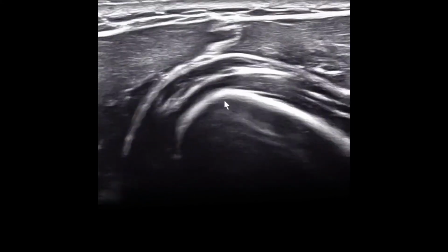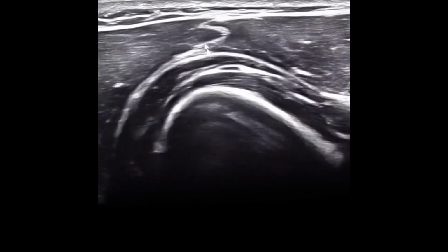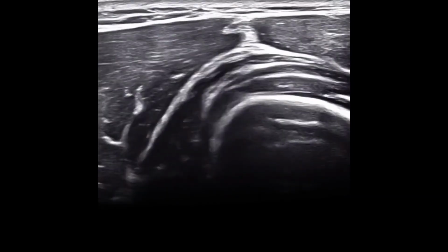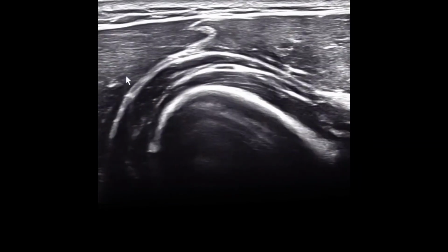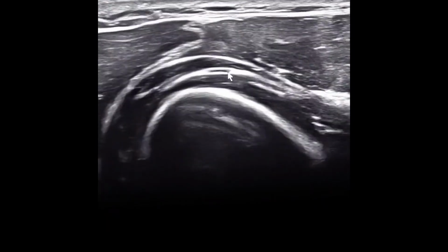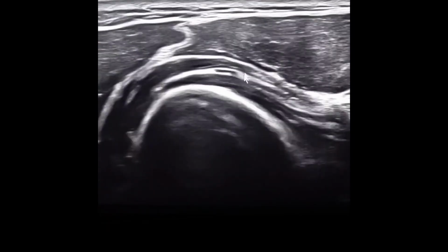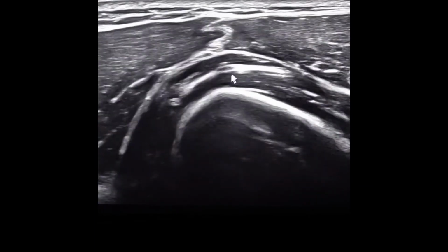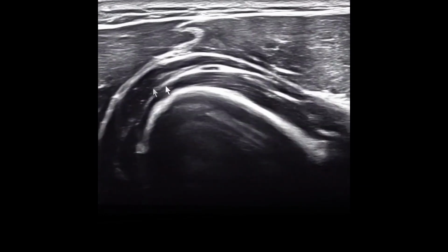Okay, so we're inside a radial tunnel. So the posterior interosseous nerve comes from above, crosses here, crosses through here, which is the arcade of Frosch, and comes inside. So you can see inside it's pretty small. It's this tiny thing, it's now splitting in two. So I'm moving down and it goes up and down.